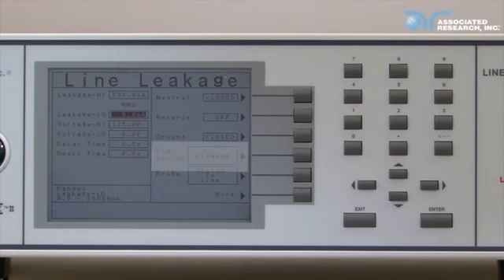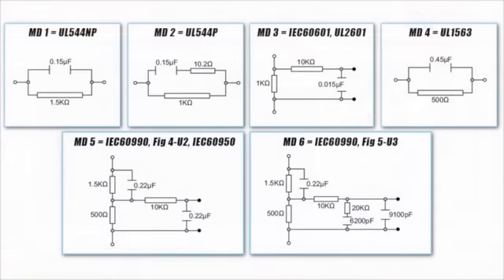Note the MD or measuring device parameter. This measuring device is designed to simulate the impedance of the human body. Select the appropriate measuring device per your testing standard.